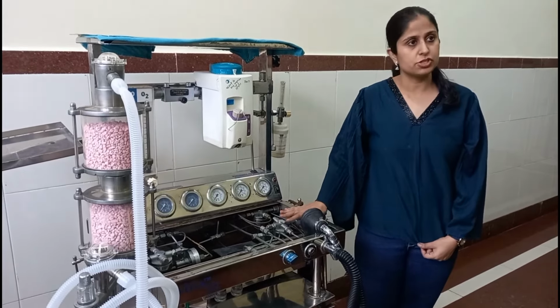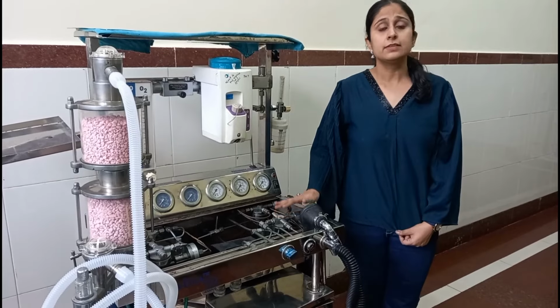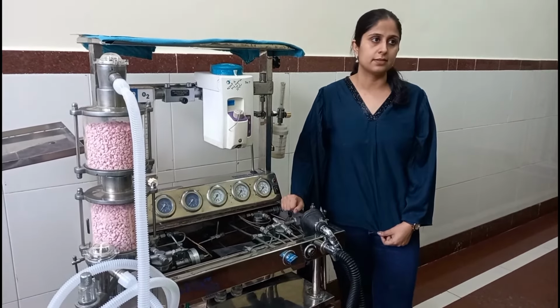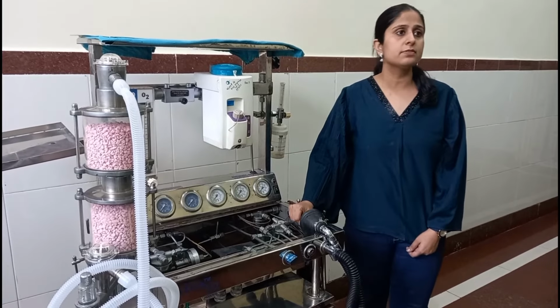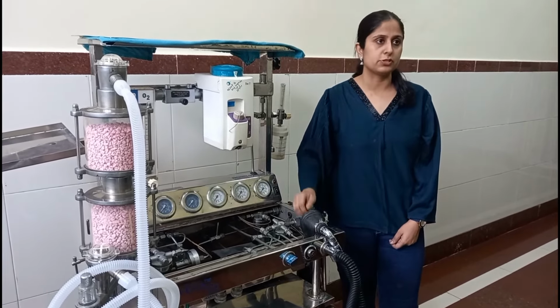Anesthesia machine is a machine which delivers a fixed proportion of a mixture of gases, which includes both the life-sustaining gases and the anesthetizing gases. The anesthetizing gases include isoflurane, sevoflurane, desflurane, and the life-sustaining gases include oxygen. So they will give a fixed proportion to the patient.